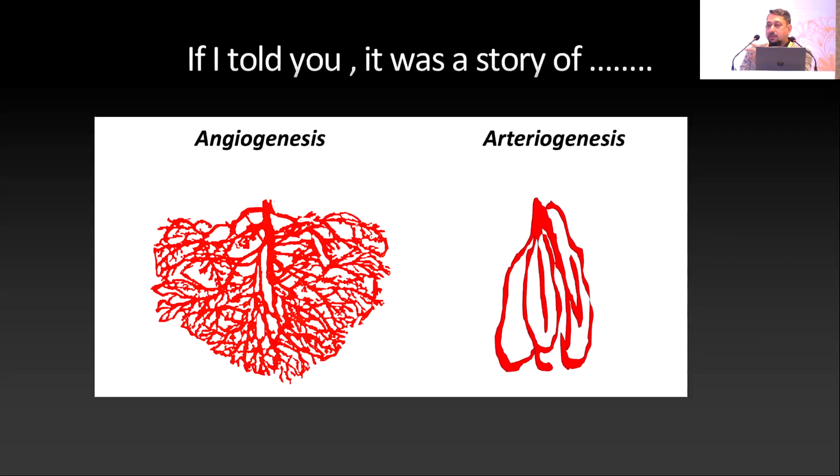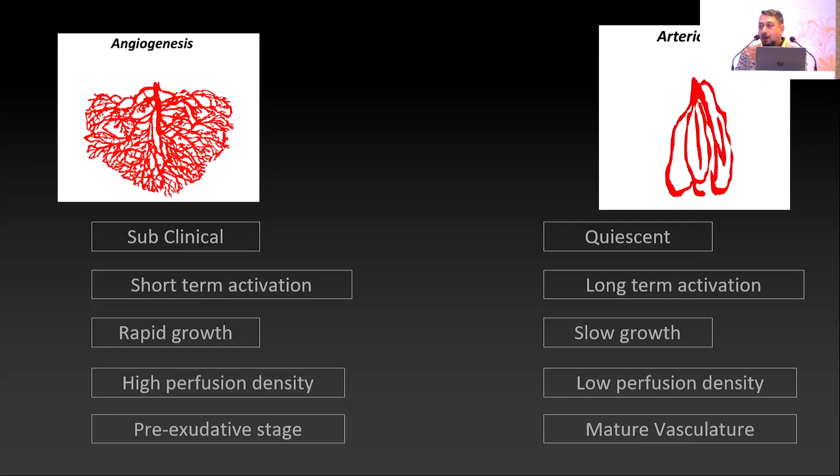Basically, non-exudatives are two types, where you have an angiogenesis with more capillary vessels and an arteriogenesis type with more larger filamentous loops, which can divide it into people who convert to an overt in a short term within 6 months or in a longer term beyond 6 months.